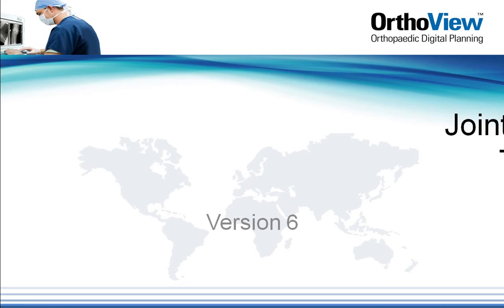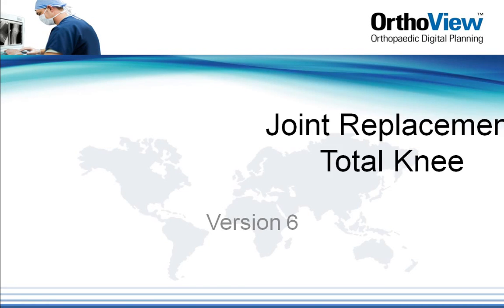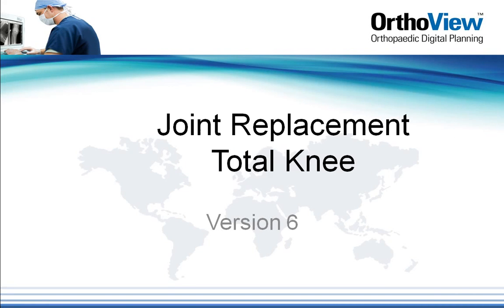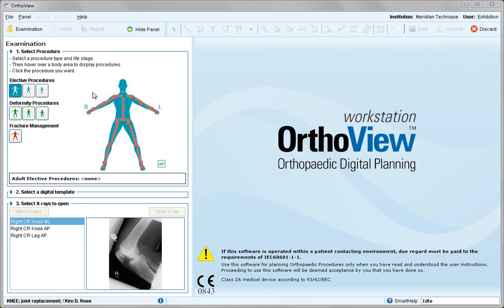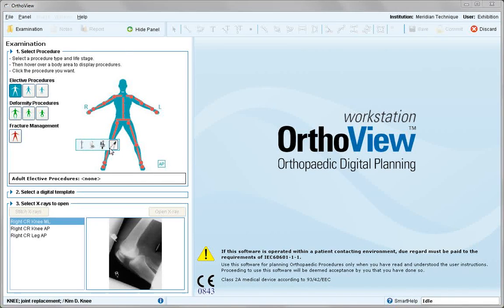This tutorial reviews the total knee joint replacement procedure. From the menu, select the total knee joint replacement procedure.